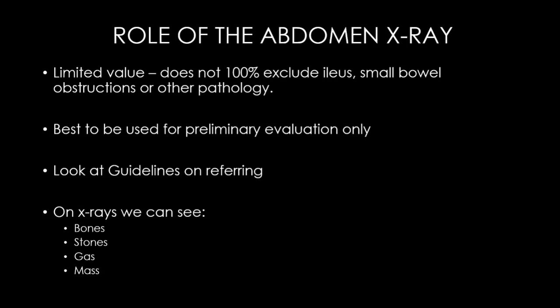You'd use ultrasound in pediatric patients with acute abdominal pain to look for free fluid or ascites and signs of appendicitis. You'd use CT in adults to look for perforations, bowel ischemia, and to look for the site of any obstruction. So x-rays can show us signs of an obstruction, but not necessarily the cause or where the obstruction's occurring, and that's where CT comes in as a gold standard.